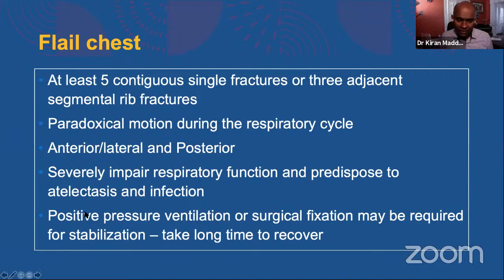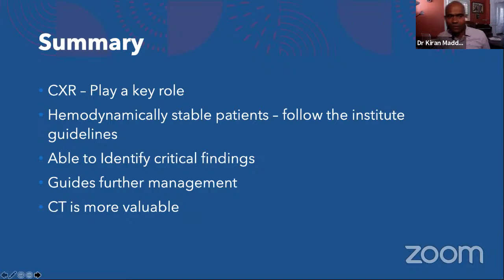But most importantly, if somebody has a flail chest, it is a severe injury and it takes longer time to recover. To summarize my talk for today, chest X-ray plays a very key role. It's a debate whether to do it on hemodynamically stable patients. So I would say rather follow the institute guidelines where exactly you are posted, where exactly you're working. It changes from institute to institute. You have to remember that all the time.